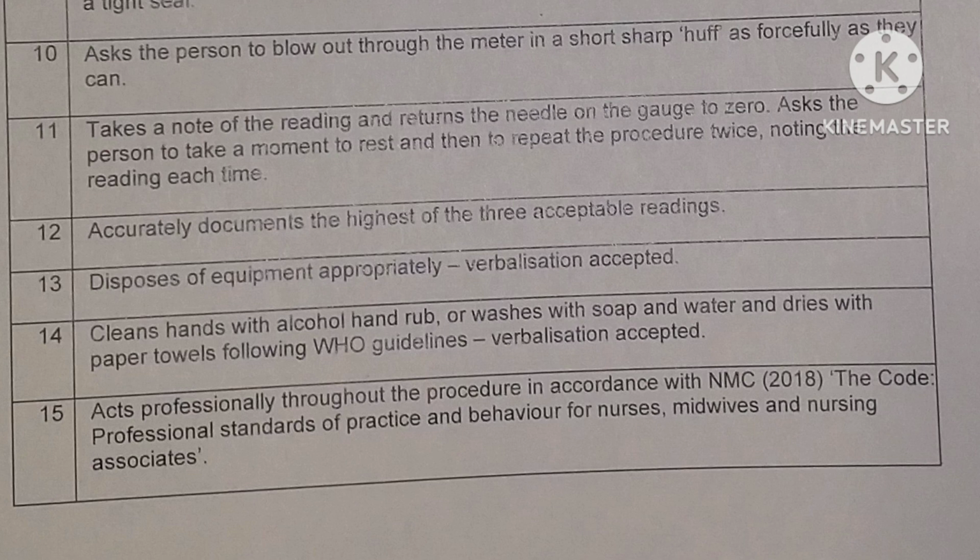Then the assessor will move the gauge for each reading and document this. Then you have to document the highest of the readings. Then we can just verbalize, we will dispose of the mouthpiece in the waste bin. If it's reusable, we can instruct them to wash it with soap and water and air dry, and they can use it. This is the way we are doing this skill.